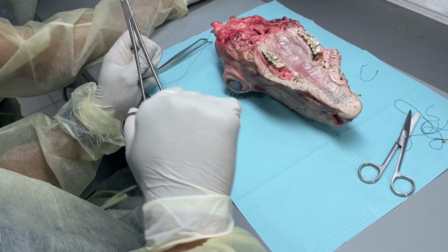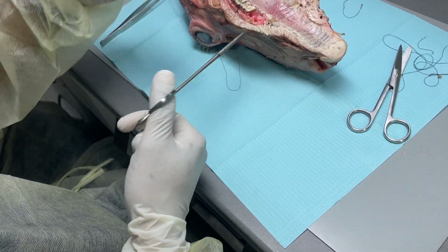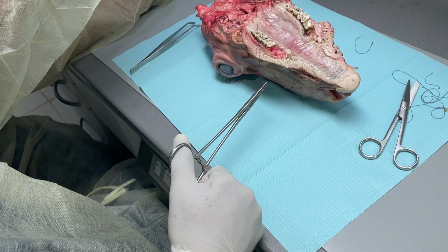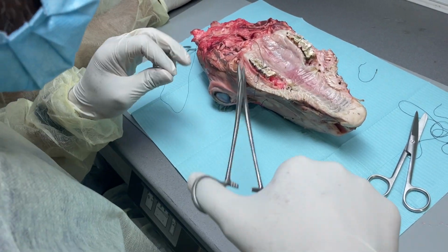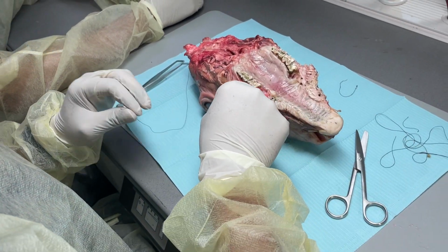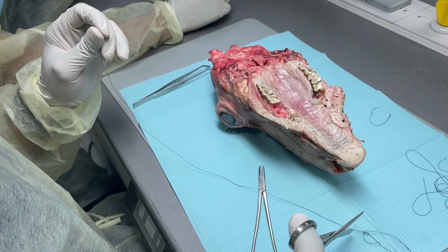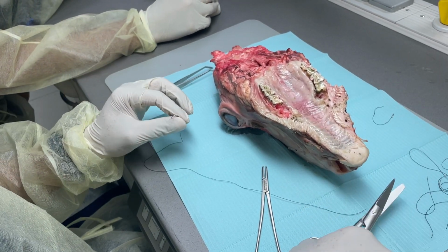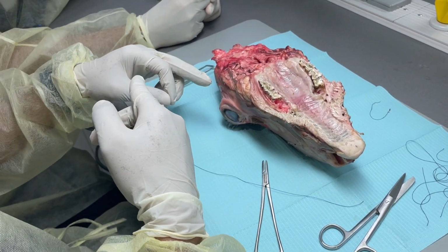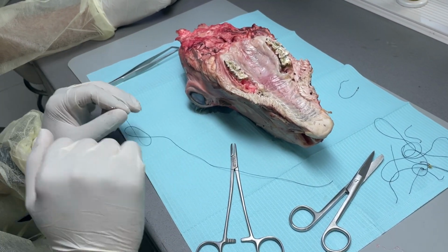Square knot. Granny's knot: double clockwise, one like this, one anti-clockwise, then one clockwise, one more clockwise. It's between the surgeon's and the square. The square is one clockwise, one anti-clockwise. Do you use it, doctor? No, because the knot stability is very bad. It will break off. Between clockwise and anti-clockwise, the anti-clockwise is to lock it. Once you put clockwise, anti-clockwise will lock it. That is why we need to give one anti-clockwise.